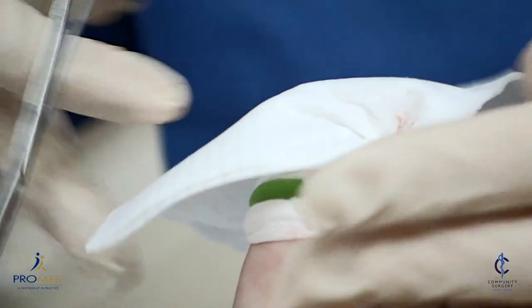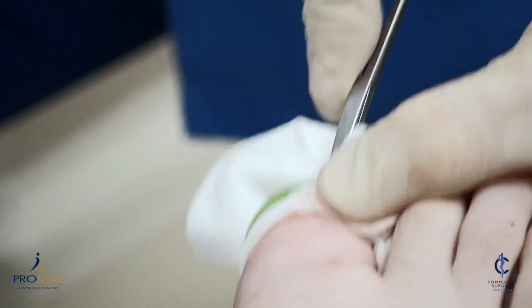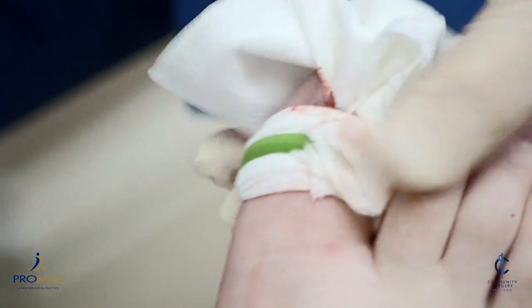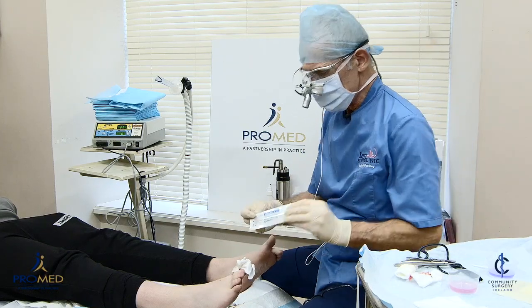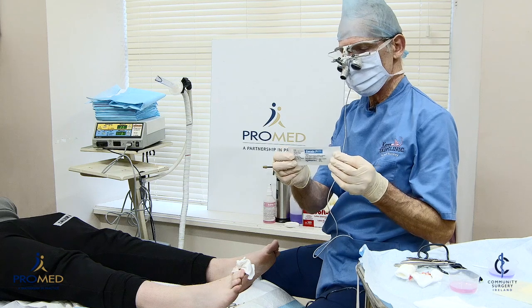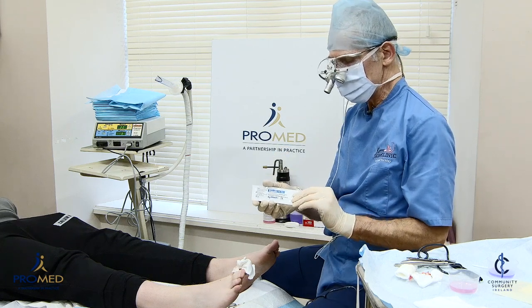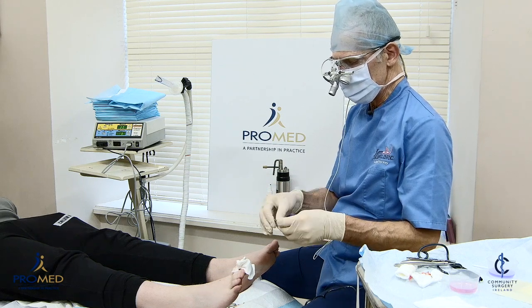I'm going to demonstrate how to do phenol first, and then demonstrate radiosurgery after. For the phenol, we use Swab-It — it's an 89% phenol with a long shelf life of about 18 months, so it's very handy.